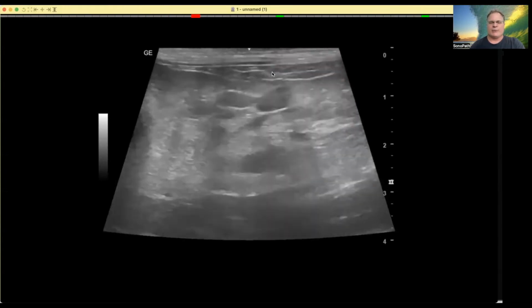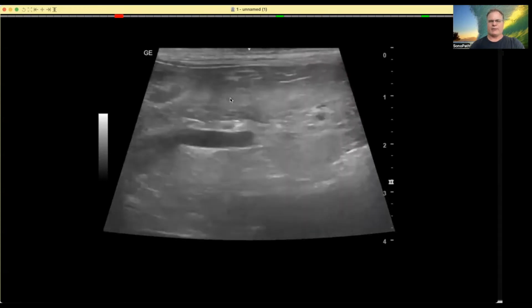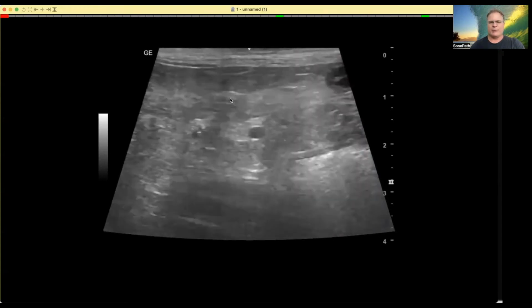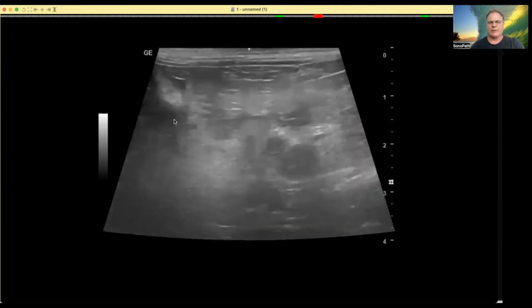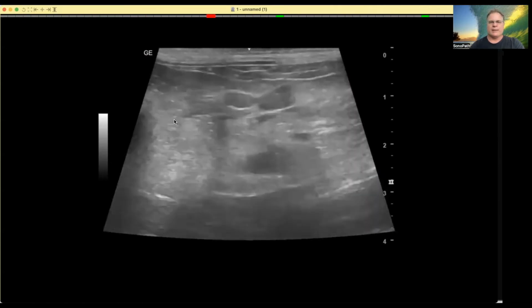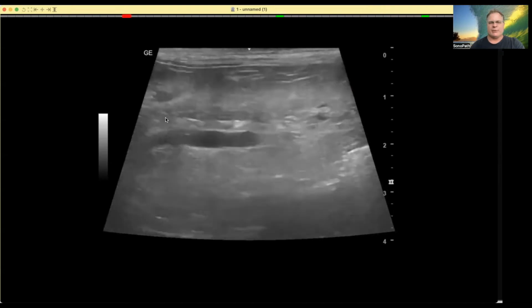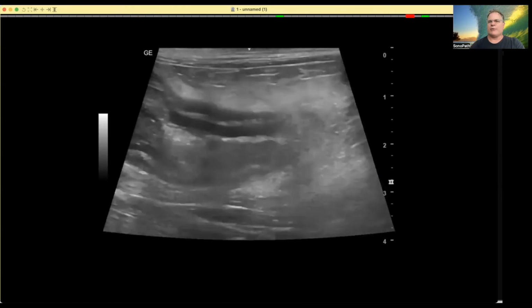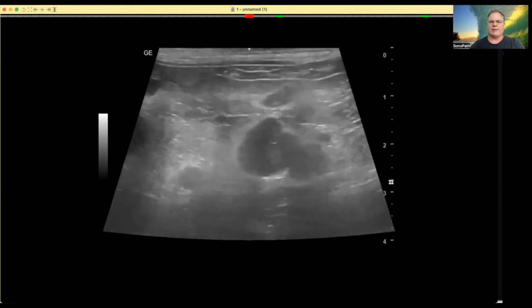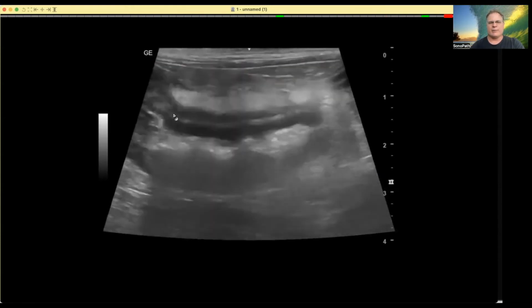This is an interesting case we ran in today, sent by a telemedicine client on an older Yorkie with an ain't-doing-right GI symptom history. You can see that the first video I run into shows this portion of intestine that is very thickened. I'm going to slow this video down a little bit.